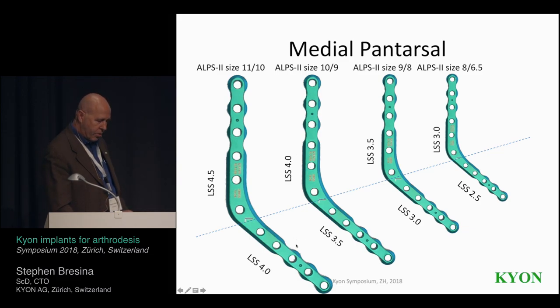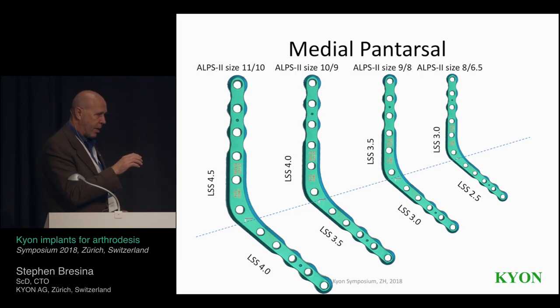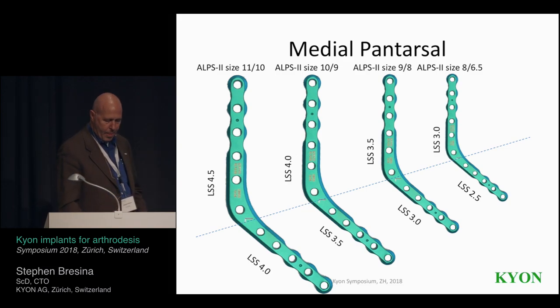As well, in these holes, other than just a locking screw, there are ways to put standard cortical screws in there if you needed to angulate to be able to grab a fragment or a bone segment that is not directly below the hole in the plate. You can angulate it to grab it.